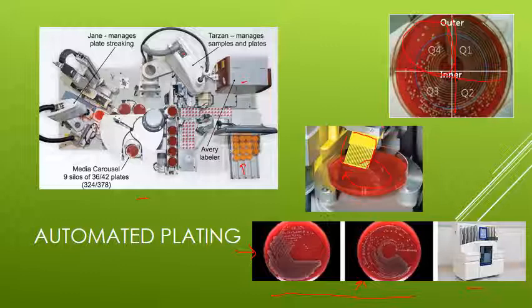And these are cups. If you have the actual tubes, the BD tubes, it makes it even easier, right? The machine will sterilely enter the tube, so you have much more confidence in the cleanliness of your plating.